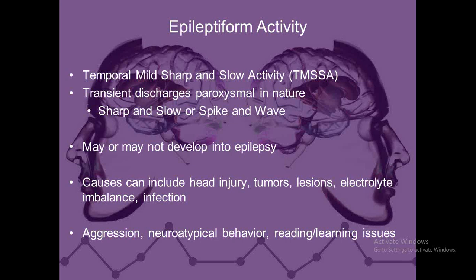Now, we can't identify or call or even put into our reports that we've identified spike and wave activity or epileptiform activity in a record, because we're not board certified to read EEGs. I've seen reports from other people that identify it, and you can't do that. We're stepping outside of our license. That's why it needs to be run past the electroencephalographer. Although our automatic spike detectors can pick up on it, the gold standard in the industry is the eyeballer looking at each one of these EEGs.